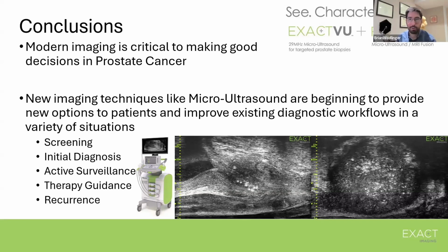We don't have very concrete evidence on it yet, although it's something that we did collect as part of Optimum and should probably be coming out along with other things like cribriform cancer diagnoses and other Gleason patterns in some of the subsequent analysis on the trial data.